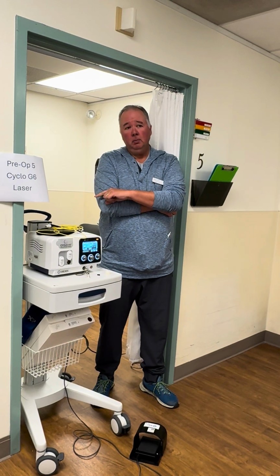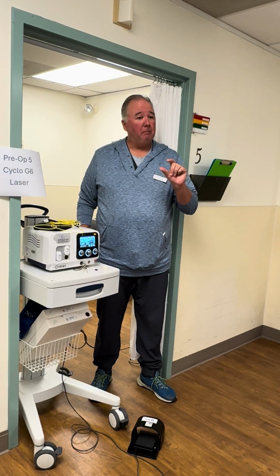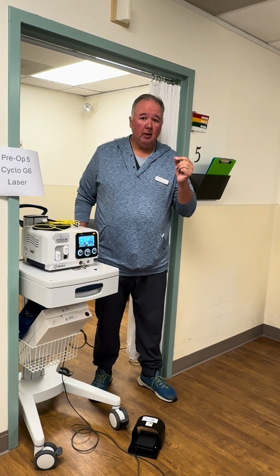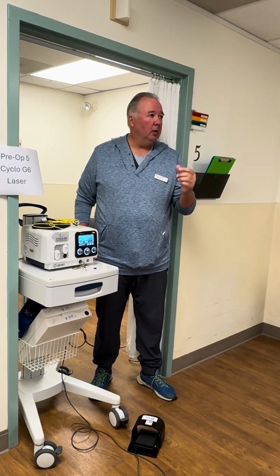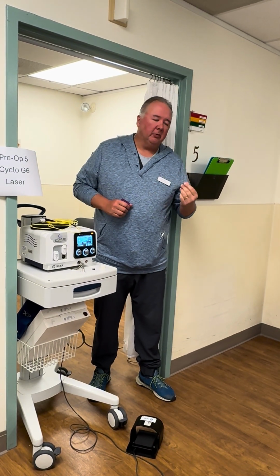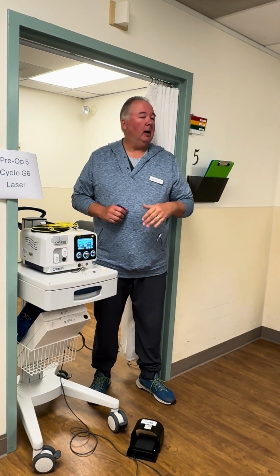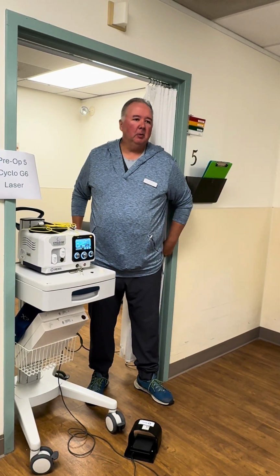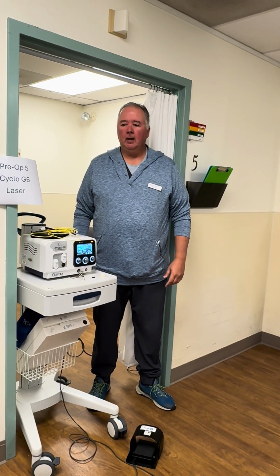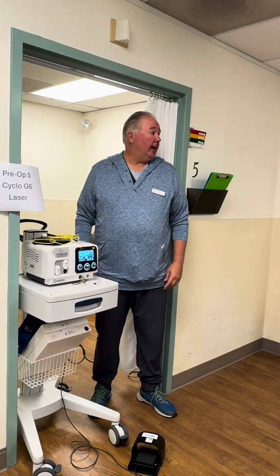Now on the G probe, one thing I forgot to mention is sometimes you'll hear a pop while they're doing it, and what you're hearing is the laser vaporizing the tissue. Some doctors like that. They go, oh, I know it's working when I hear the pop. Sometimes it's too much, so they may turn the power down a little bit till they don't hear a pop. Doctor preference. Some like to hear it simply because they know it's doing something. So just in case you hear a pop, it's not a bad thing. It just happens.